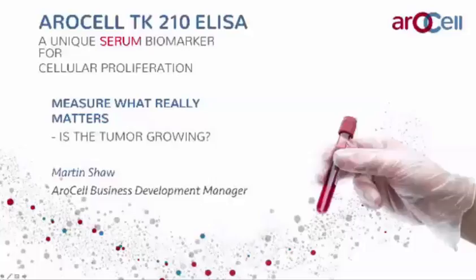How does the TK210 ELISA compare with enzyme activity assays, especially the DiviTum assay? This is Martin Shaw, and this is a bit of a follow-on from the earlier question about Liaison. But one must remember that the DiviTum assay is an enzyme activity assay, such as Liaison was. And one must be careful that when you're comparing an enzyme activity assay and ELISA, you're comparing apples and pears. The enzyme activity assays measure, of course, the activity of the enzyme, whereas the ELISA assays measure the mass of the protein. In hematological assays, as we mentioned, they give very similar information, but in solid tumors, the ELISA methods are more sensitive, probably because they're also detecting the inactive forms of the TK1 protein.